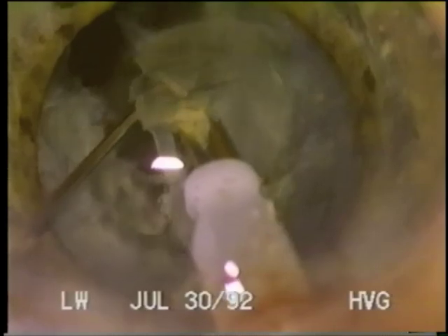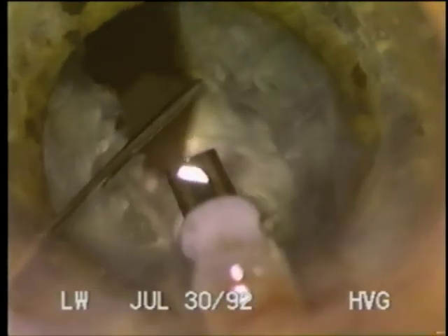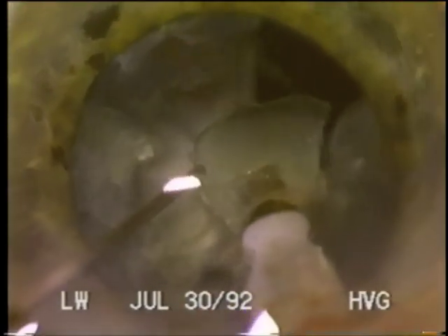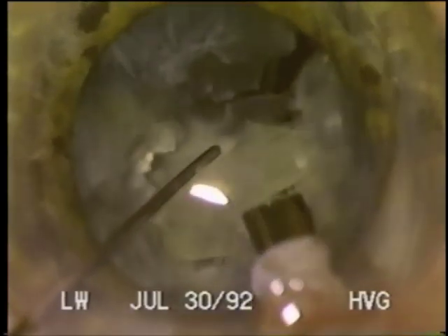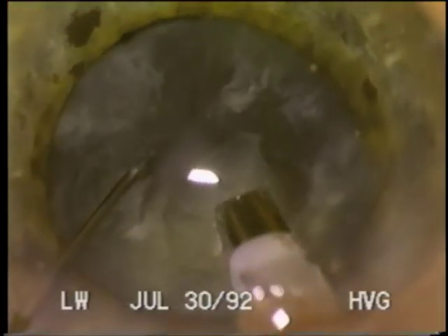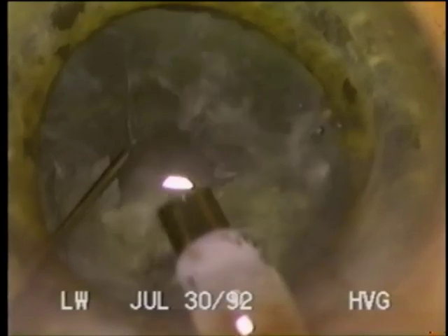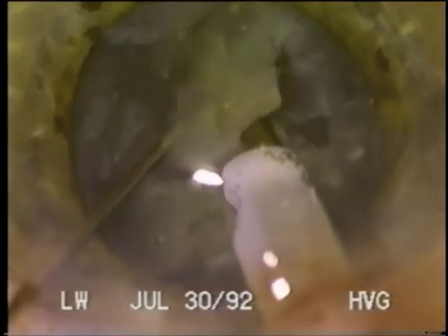In this case, after fracturing into six segments, the first segment is brought to the center of the lens for emulsification. High flow and high vacuum and low ultrasonic power will help to keep those segments fast to the tip, reducing the chances of the segments tumbling into the chamber. In general, the more dense the lens, the smaller the segments should be. If the segments are too big after initial fracturing, additional fracturing can be obtained as the segment is engaged with the phaco tip.